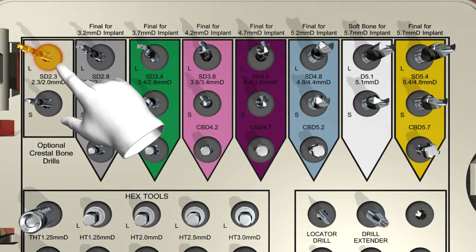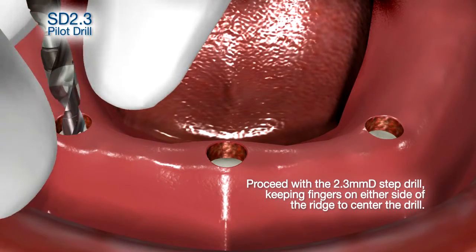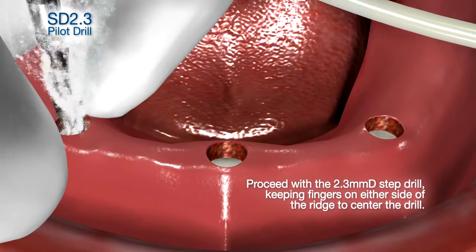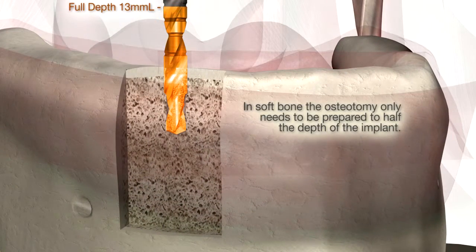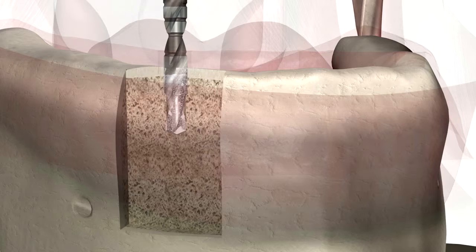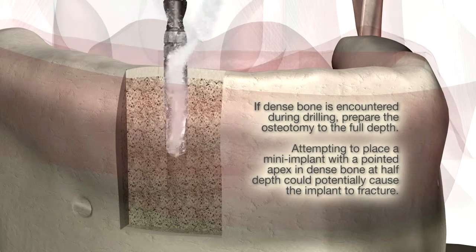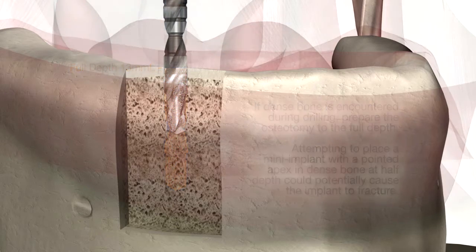Select the 2.3 drill. It steps down to 2. In relatively soft bone with the pointed implant, you can stop halfway down and the implant point will work its way through the bone because of the sharp end. If the bone is dense, then go ahead and finish the site to the full depth. If you attempt to place a pointed implant in dense bone that's only been prepared half the depth, there's a chance of fracture.